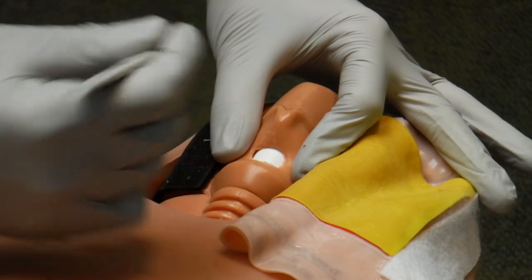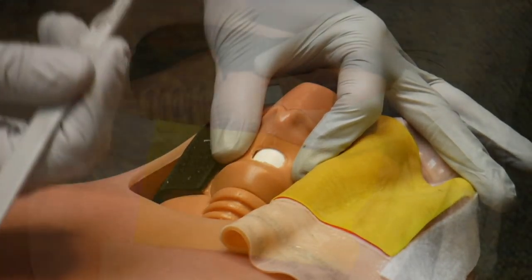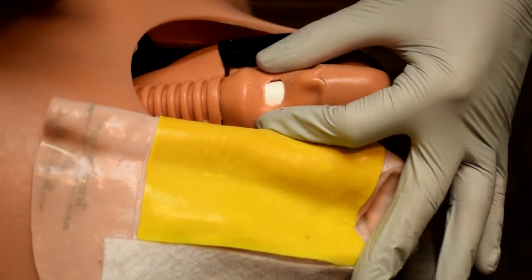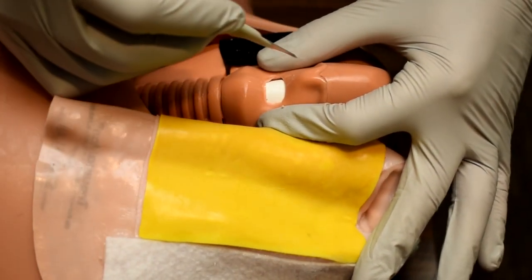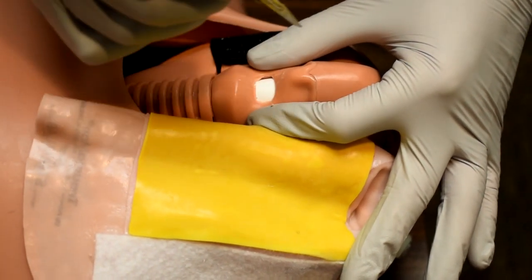When we're using our knife to do the procedure, we're going to cut away from ourselves so we don't hurt ourselves. You can use an 11 blade, you can use a 15 blade. You can use any blade that you need. This is an emergency procedure. You should cut away from yourself. You do not want to cut toward yourself and slide into your hand.